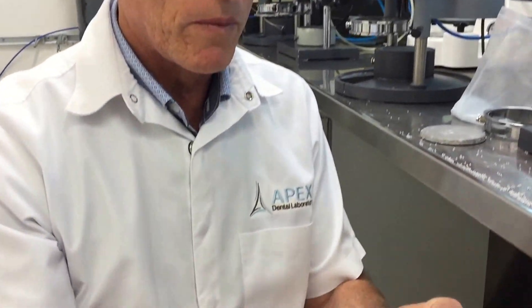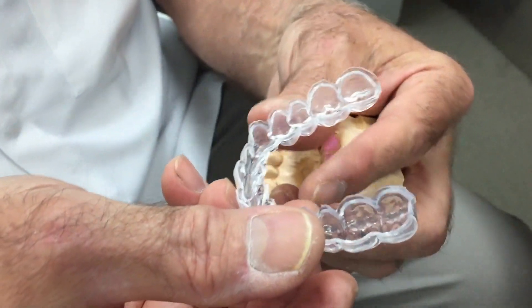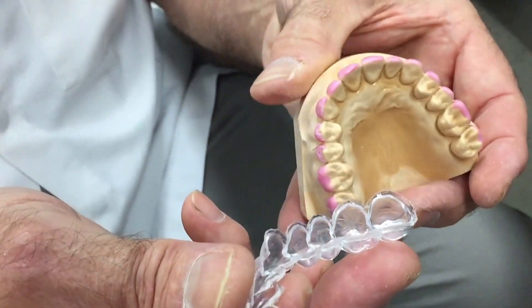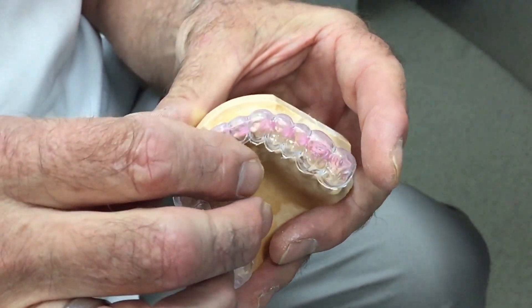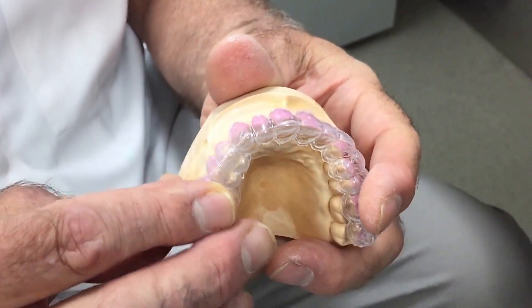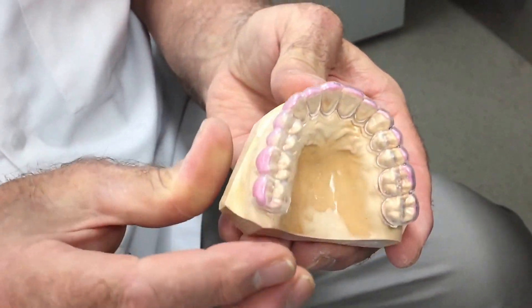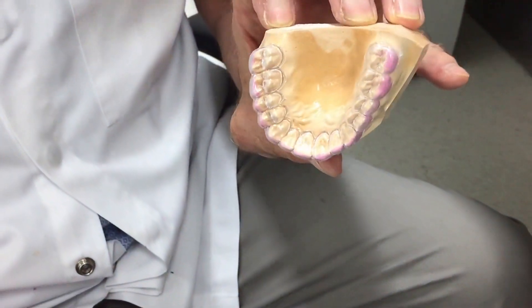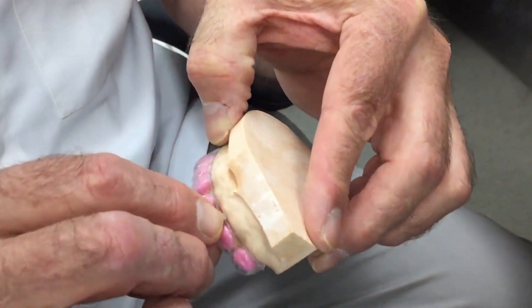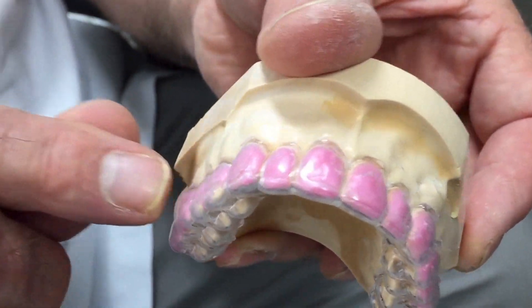There we have it — trimmed completely around, scalloped following the gingiva. Remember, the purpose is to limit this chemical burn to the oral mucosa. Quite often practitioners are dispensing a chemical stronger than what can be bought at the chemist shop, so it behoves us to make sure that chemical doesn't do damage, bearing in mind that patients don't always follow the right instructions. Here we have a nicely fitting bleaching tray — not stretched, seating right against the gingiva — and it's going to be the most effective way to carry chemical to the surface of the teeth.